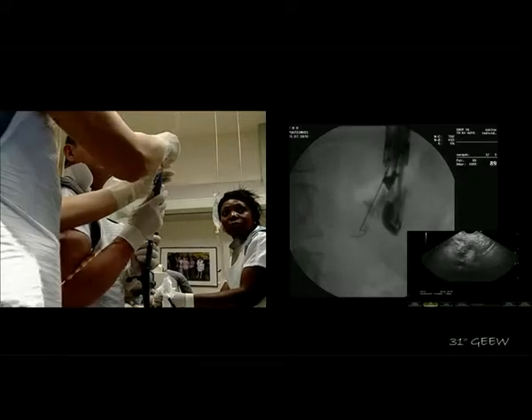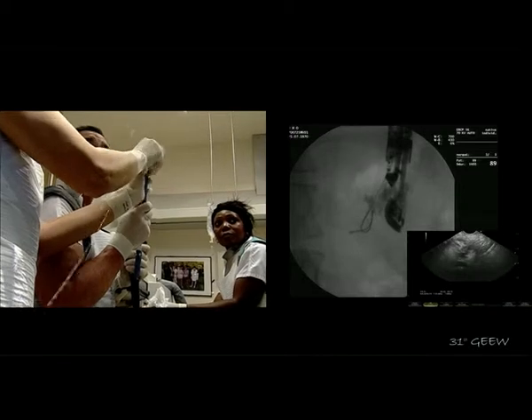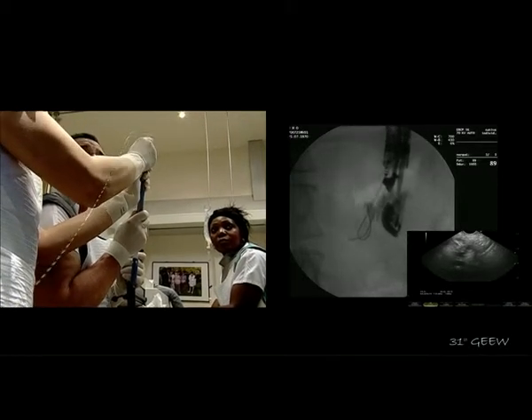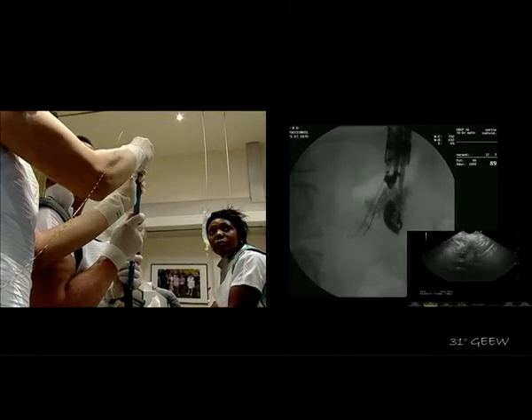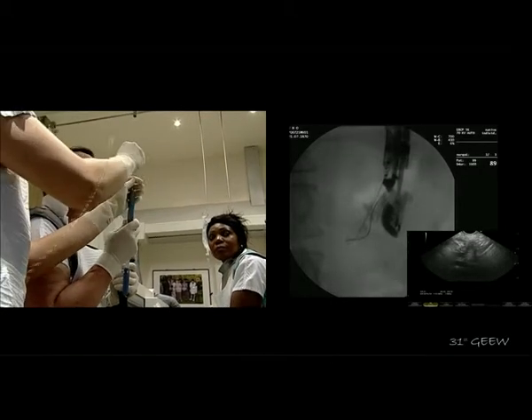Oh, that's not bad. Yes. Yes, fantastic. This is good. Perfect. Oh. Yes. Excellent. Okay. Excellent. Now I remove my needle.